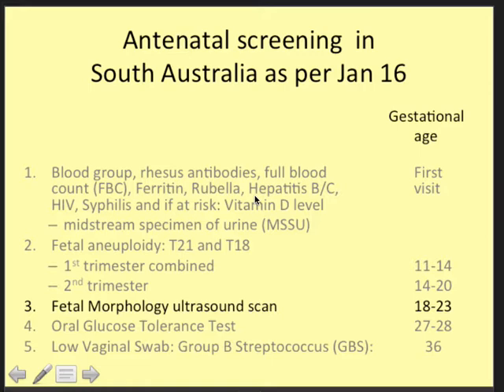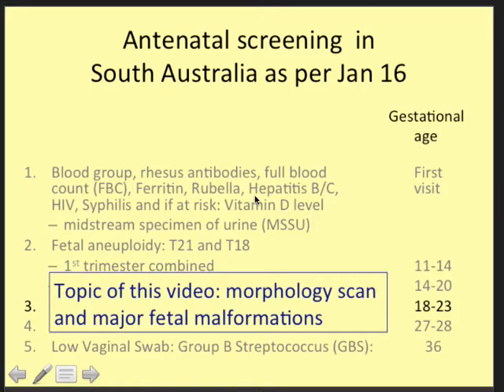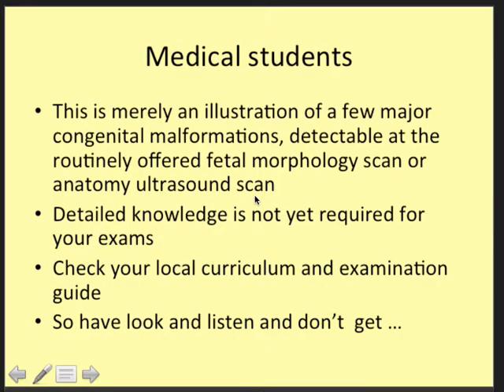As you know, we presented already part 1 and part 2, and this is the topic of the video today, the morphology scan and a focus on major fetal malformations. For the medical students, this is merely an illustration of a few major congenital malformations as sometimes can be found when we offer routinely a morphology scan or an anatomy ultrasound scan to pregnant women. This is part of screening.